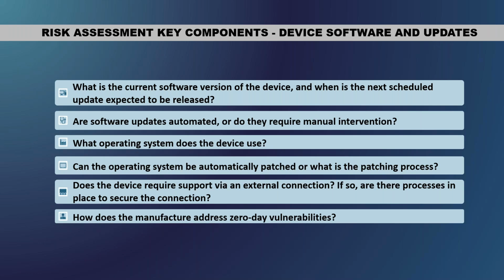The automatic patching. So patching is a big thing, obviously, for medical equipment. A lot of systems, the vendor cannot patch it either because it takes down the system and then that will affect the clinical workflow. So what we always try to ask is, can it be automatically patched, or do we have to plan a patching solution for the vendor? How is it going to be patched?